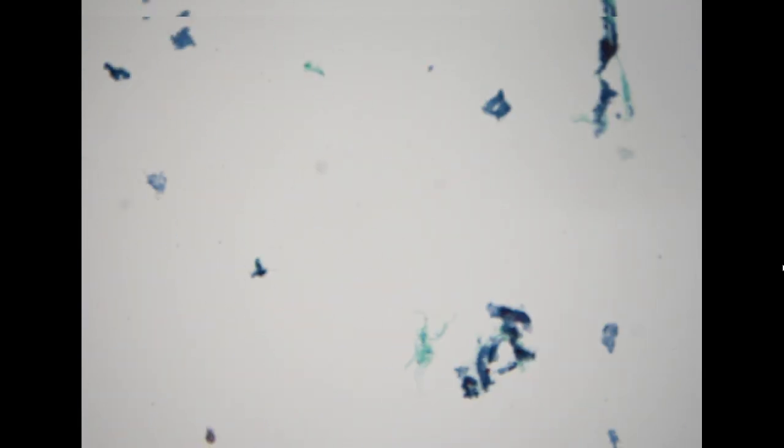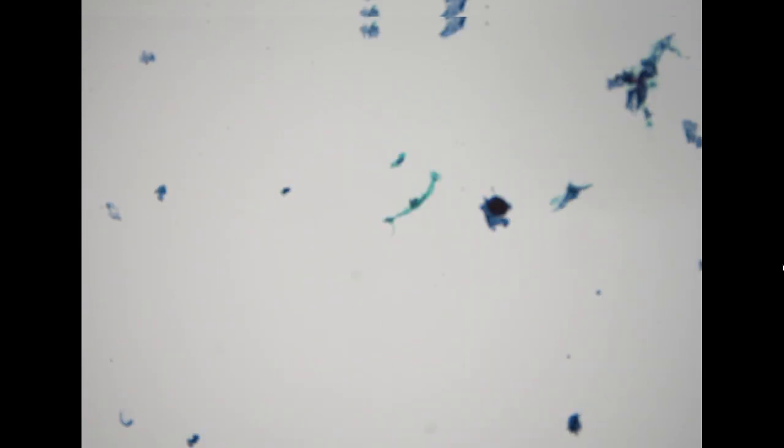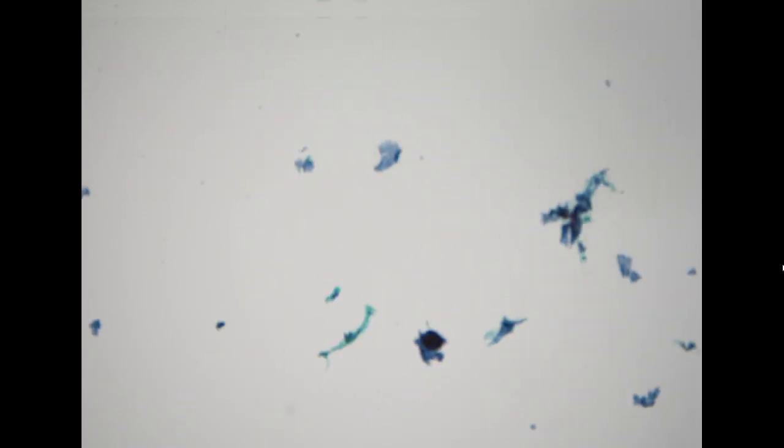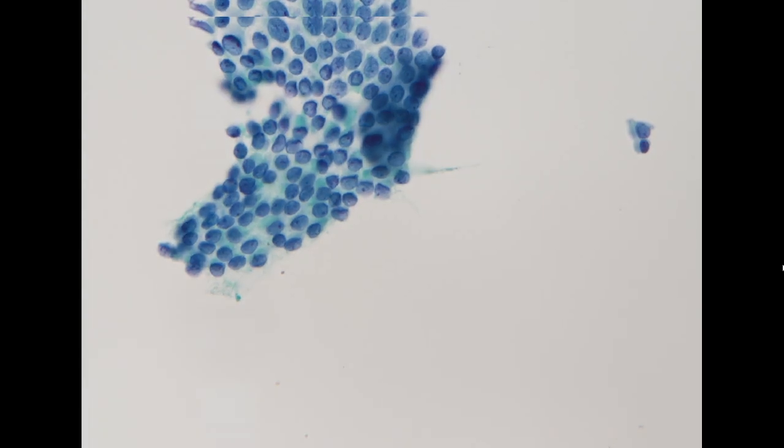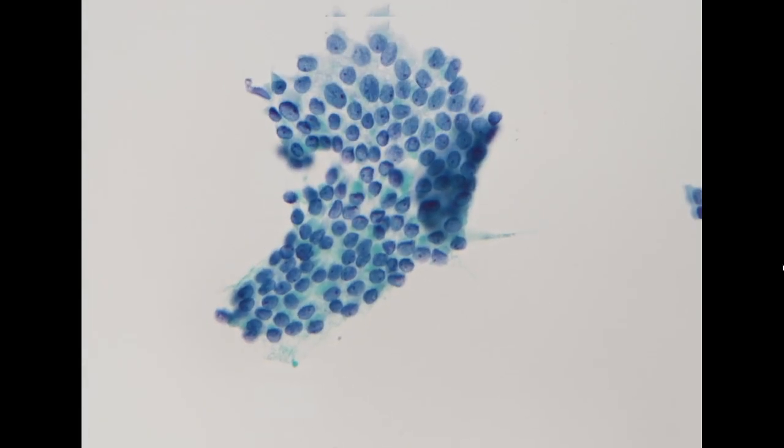Here is also a multinucleated giant cell. Just based on this low power view, with no colloid, hypercellularity, and the arrangement we see being monolayer sheets and papillary architecture, we suspect it is a papillary thyroid carcinoma. What we need to do is go to higher power to confirm the nuclear atypia of a PTC.